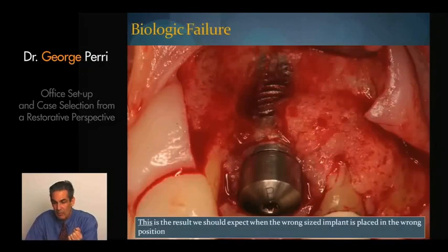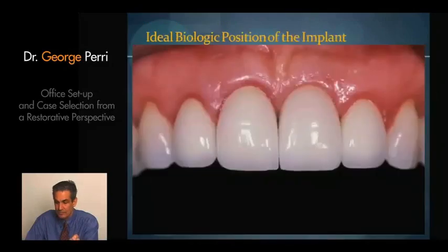And here we see a 5 millimeter diameter implant that had been placed, no bone labially, and probably even worse is that the implant was placed so close to the natural central incisor, trying to maintain that bone can be extremely difficult and lead to future problems. So removing that implant, grafting the site, perhaps extracting the retained deciduous canine, placing an implant in that site, and we might consider, and we have, cantilevering the lateral incisor off that implant on the canine site, just because reconstructing this site now that is so damaged by a malpositioned implant, it's very difficult to proceed with the case.